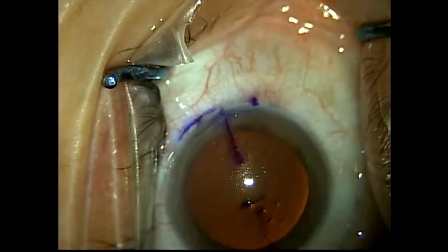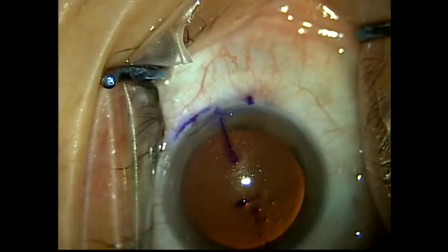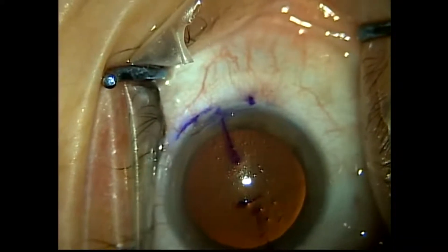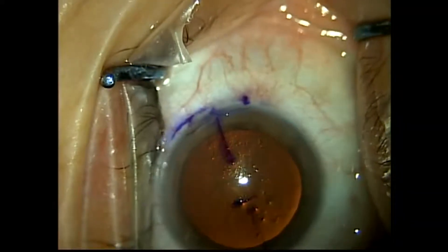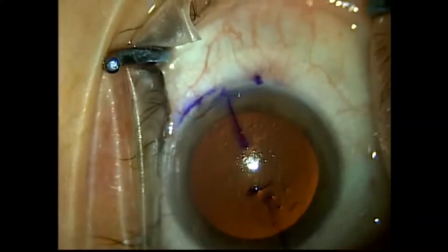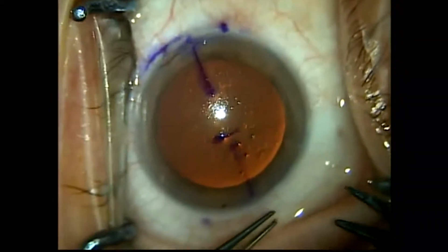That patient had 1% lidocaine, topical only. I usually do not use intraocular lidocaine, as 99% of the time when I use intraocular lidocaine the patient moves.